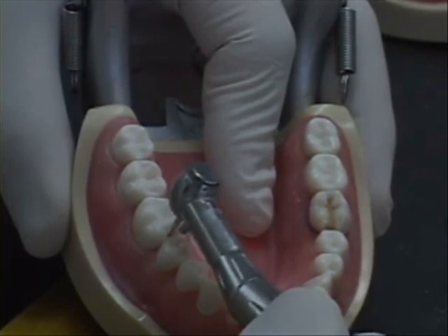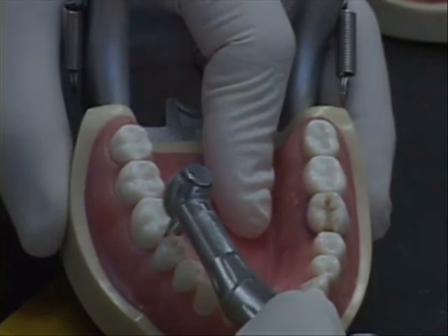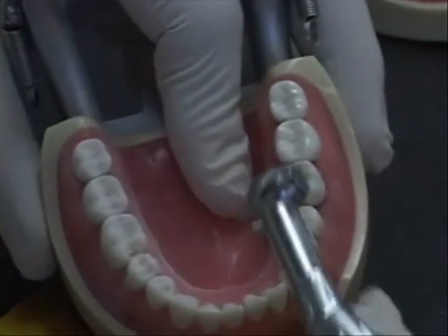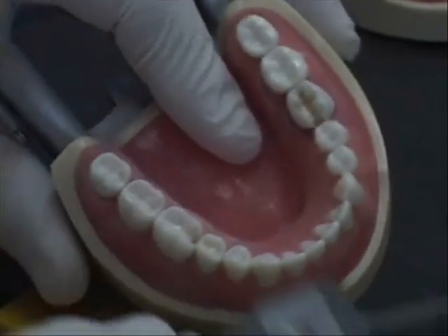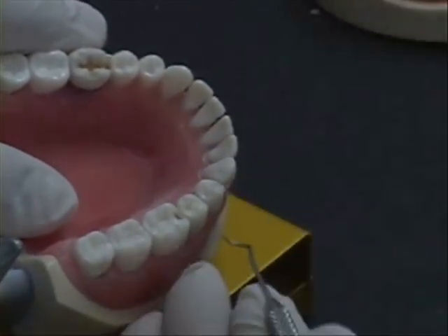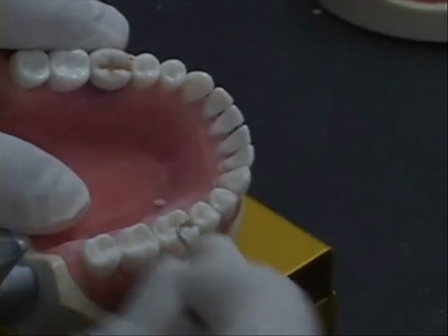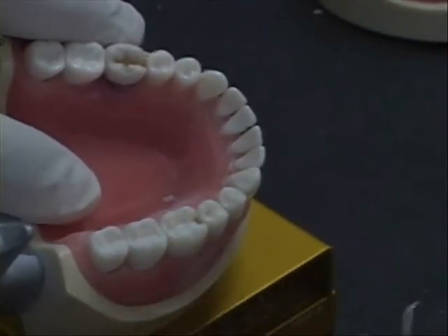Now what's really important when you're doing the slot prep with the summit design, which is what they want on the revs, is you need to make your extensions very conservative. So here, I'm going to blow this dry here. And as you can see, approximately here, this explorer tip goes up through underneath. And now I can break away this little flash of enamel. You just see it flake off with my explorer.